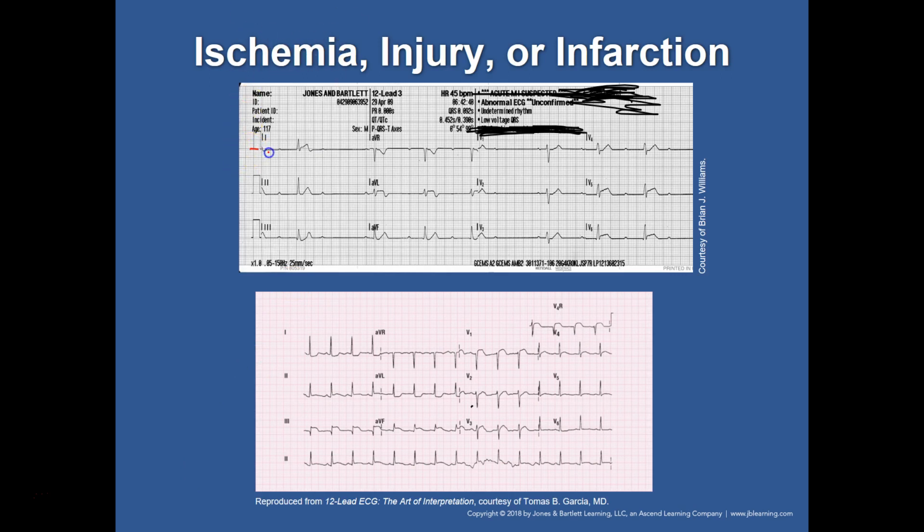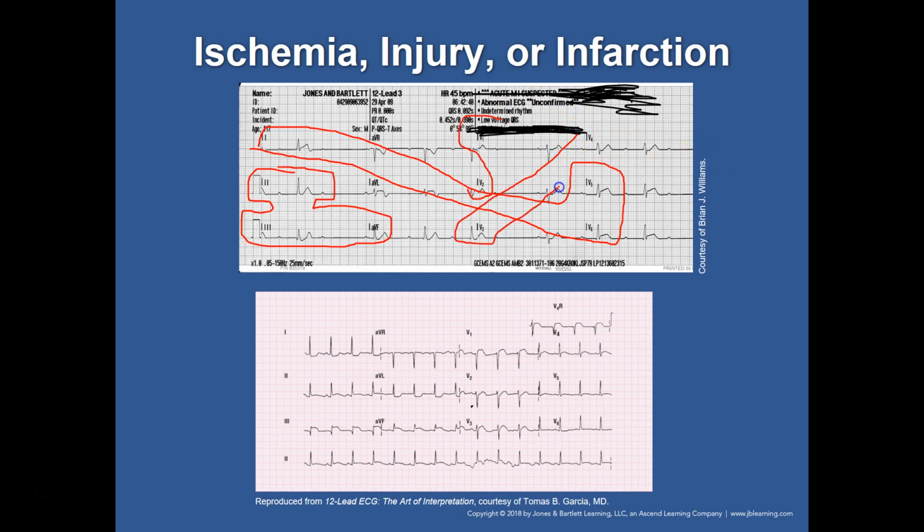So, as we said before, this is the first lead. What I like to do is go ahead and make my groupings, and then go ahead and look at everything. So, number one, I'll start with my L. Let's see what we see here. Looks like we've got a little bit of elevation right there, don't we? We go into L, which I did not get circled very well, did I? Now I've got a mess.